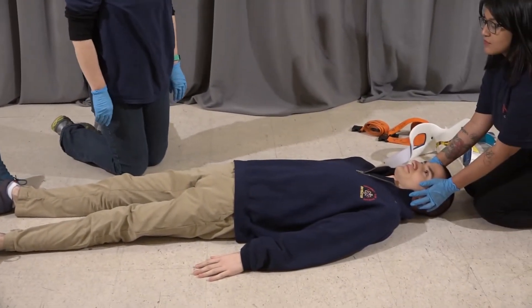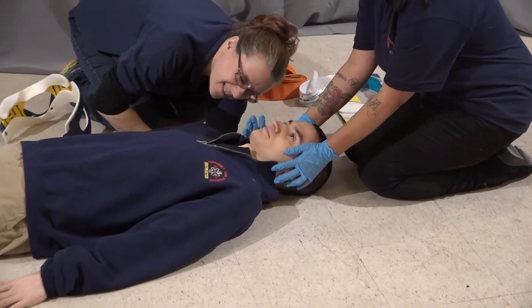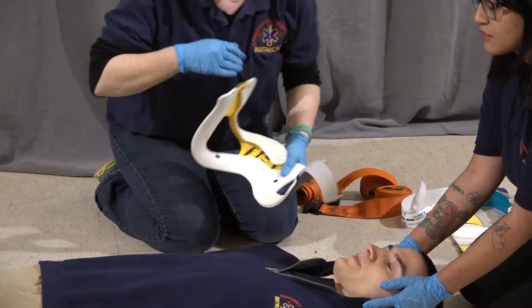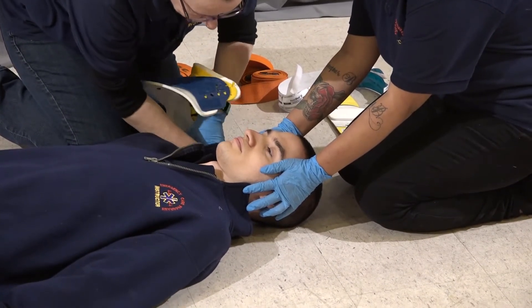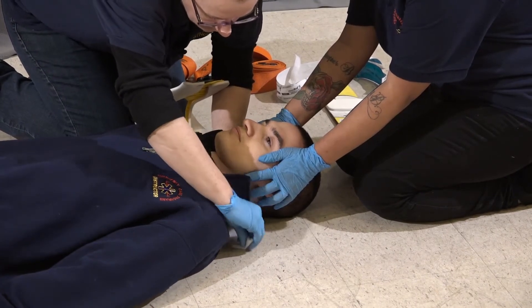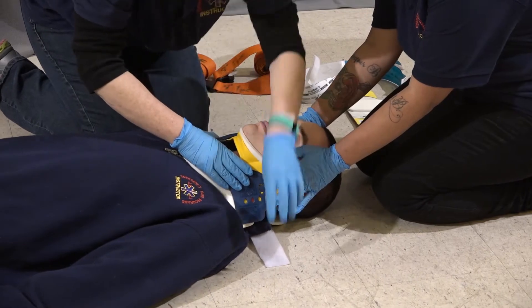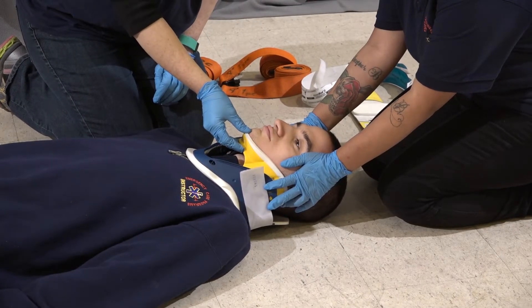I'm now going to measure and apply a cervical collar. I'm going to insert the collar through the void of the neck just until the tabs show, which will then allow me to bring it up under the patient's chin and along their breastbone. Make sure you don't push it back too far so it doesn't interfere with the patient's breathing.